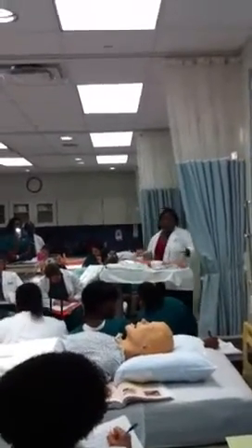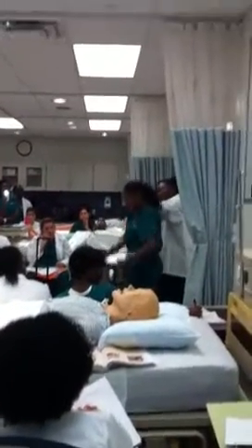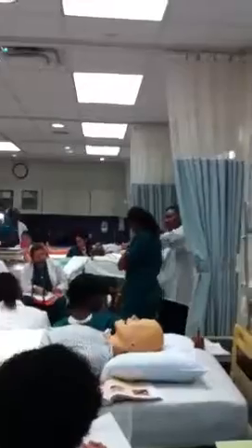Can you get up? Let me show you. I ain't going to kill her. Turn around. She's not getting the fluid.